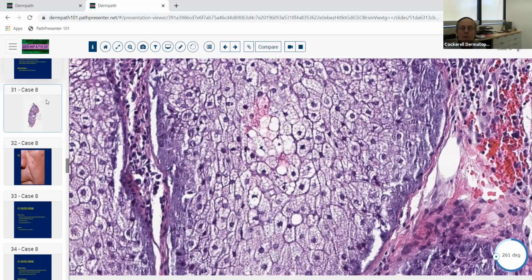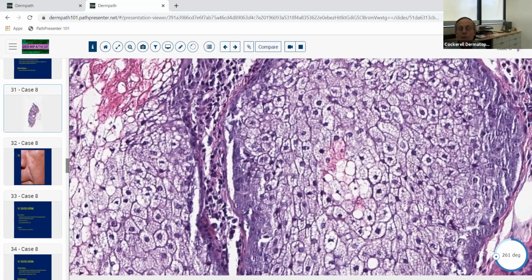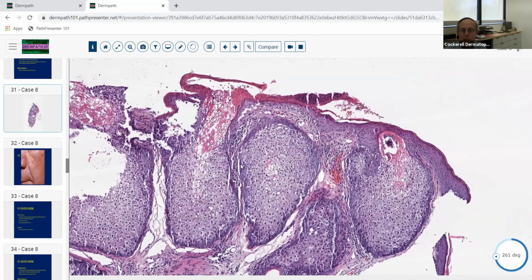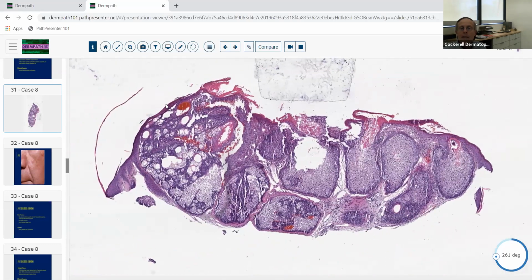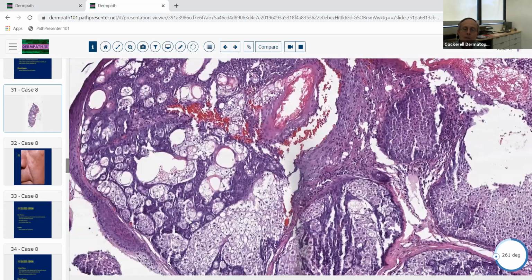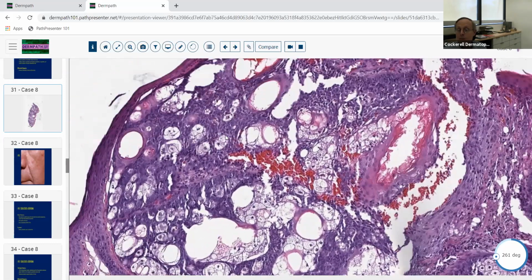And sebaceous actually will also undergo holocrine secretion, which you see going on over here. So this is a benign adnexal neoplasm with sebaceous differentiation. Notice the shape of this. It's got a cup shape to it. So whenever you see a cup-shaped papule that's comprised of more than 50% mature sebaceous elements, and here is some on this side, or some of these more primitive germinative cells.